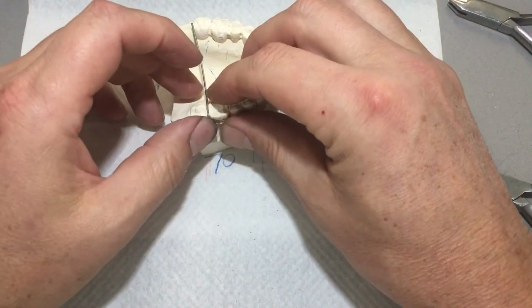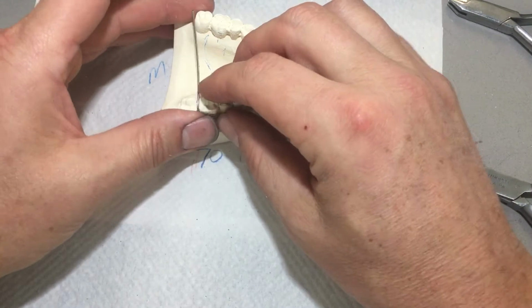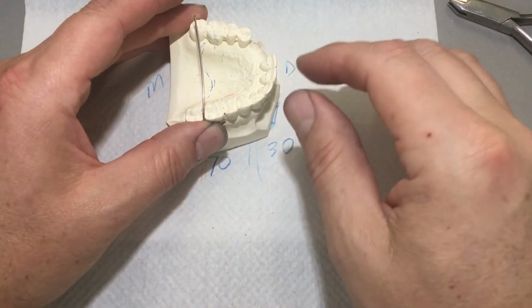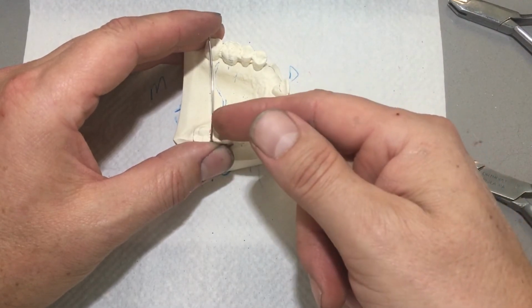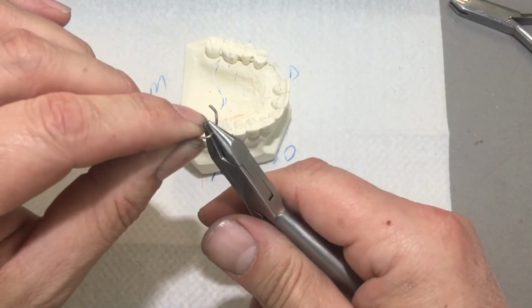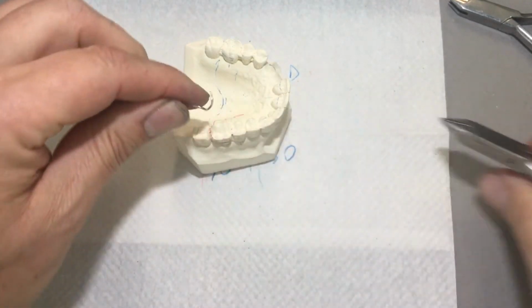This kind of reminds me of the Adams clasps you built. Did you not have to cross the occlusion? And at this point, did you not have problems here a little bit? Or no, you're just awesome. Okay. I'm the one that doesn't do ortho, so maybe I'm having a more challenging time.